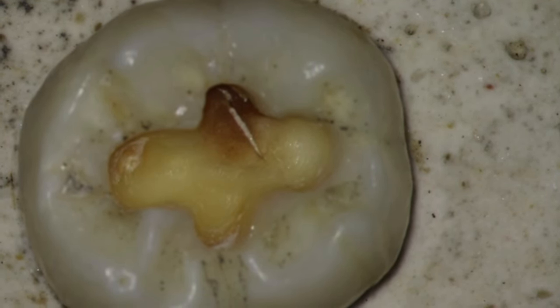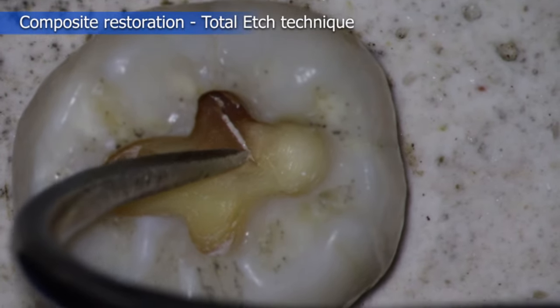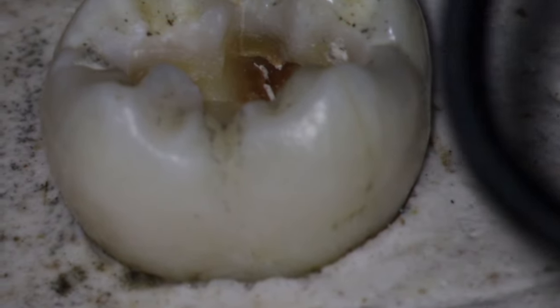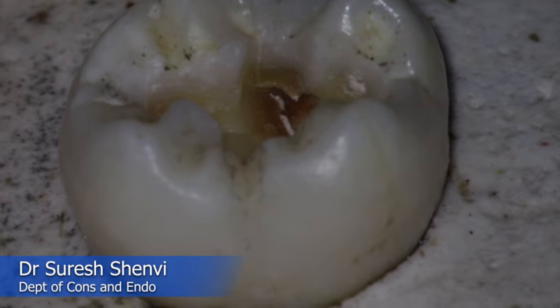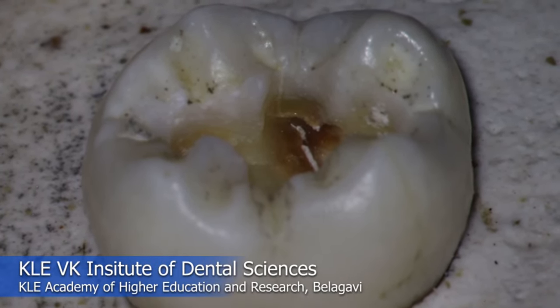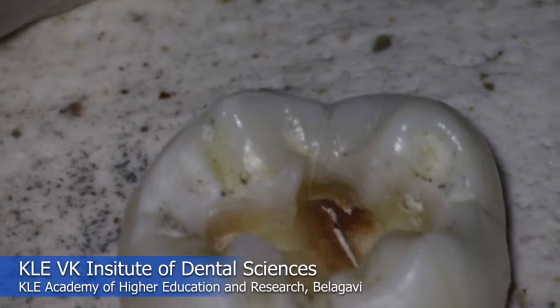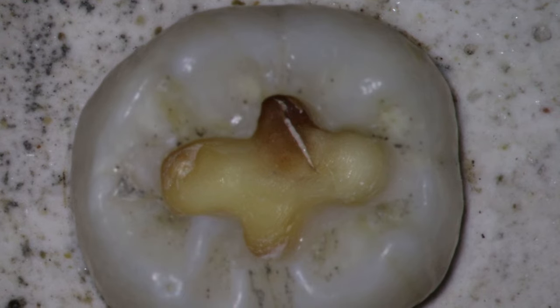So this is a case of caries excavation, and we'll try to learn how to do composite restoration here. You can see in this cavity there is yellowish dentine, and if you see it from sideways, you will see a junction where there is white color enamel and yellowish dentine. Some of the teeth will have this kind of configuration, so it sometimes helps you to do selective etchant application, which I have discussed in my theoretical video.